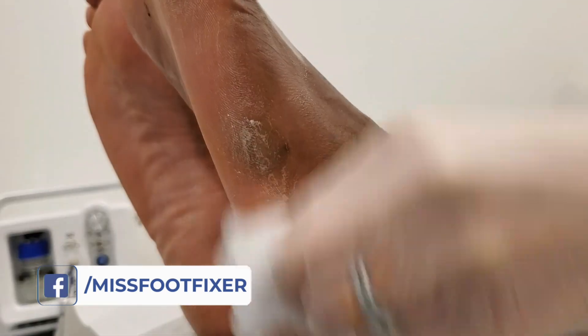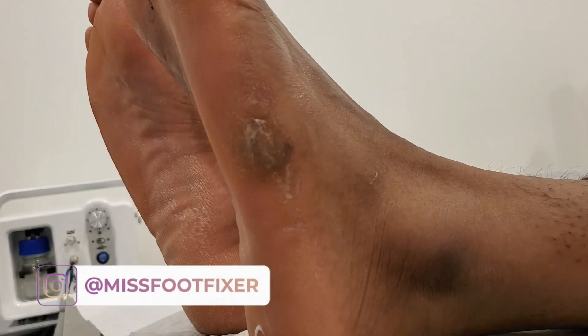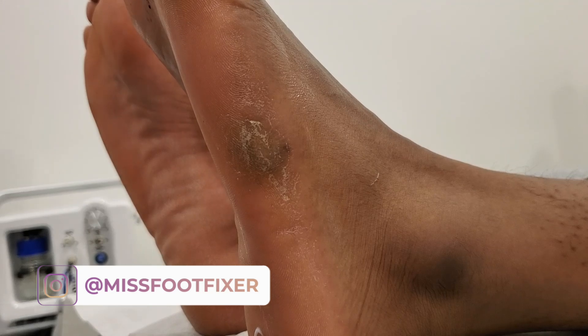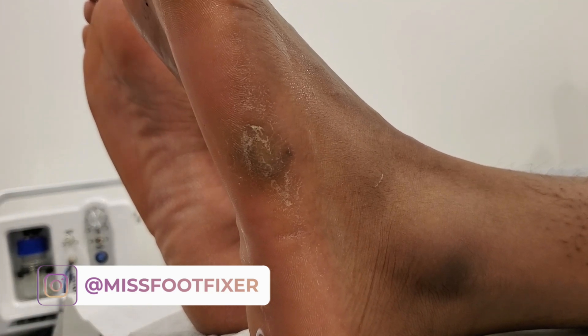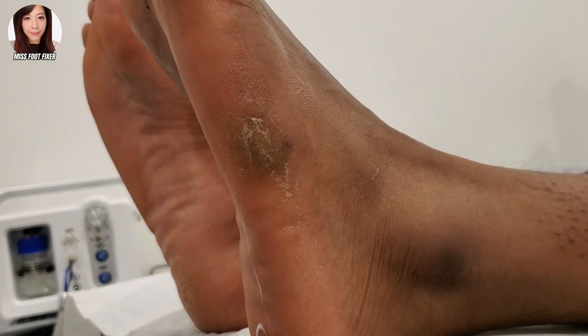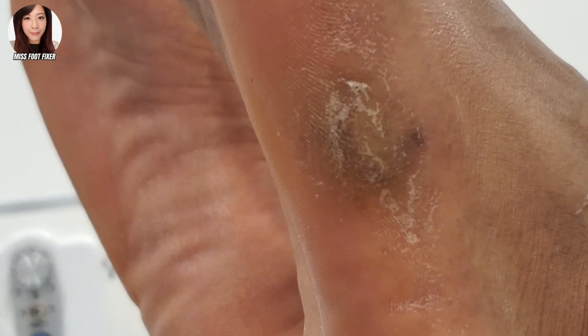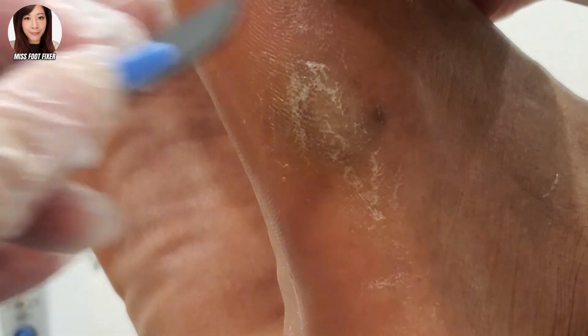Hello everybody, it's me, Miss Foot Fixer. Just putting some cream on because it's really super dry, just to rehydrate this a little bit so when I remove it it's just a little bit more easier. We've got some callus on the side of the foot — some beautiful thick callus, thicker than usual actually. Is it painful? No. Okay, so I'm just going to zoom in and start treating it.